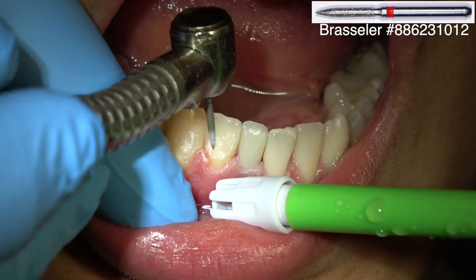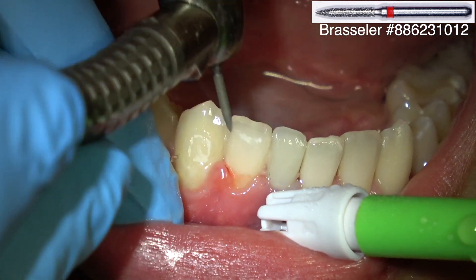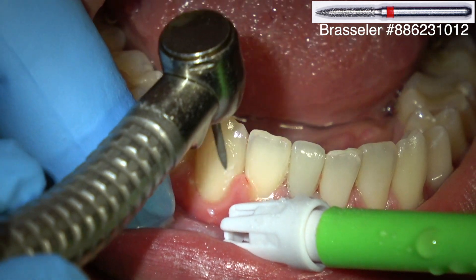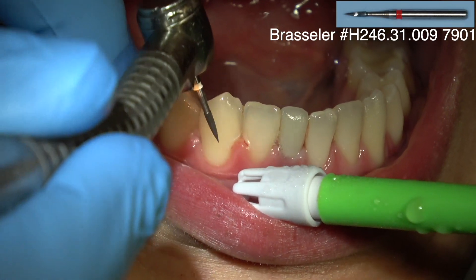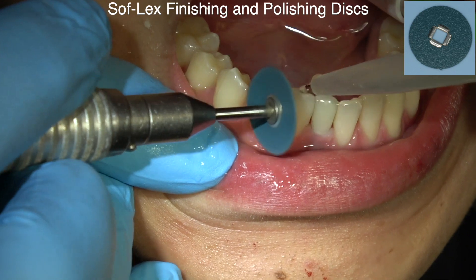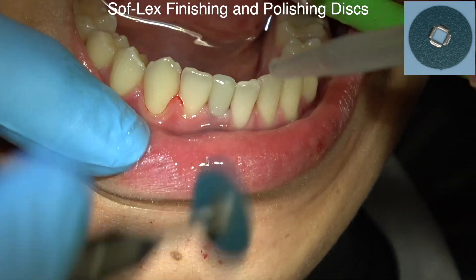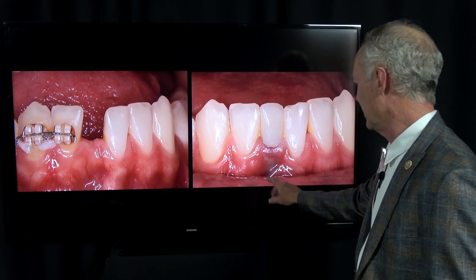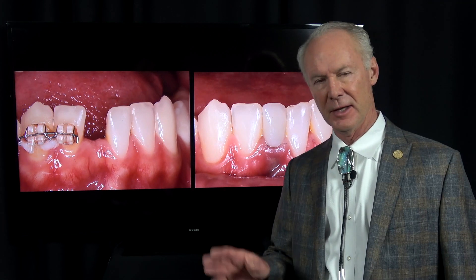Remove these orthodontic wires — the patient was undergoing orthodontics at the same time, and the orthodontist wanted the restoration placed before he removed the orthodontic band. So I'm removing them for him this day, just polishing those off with a flame-shaped fine diamond and then a 30 fluted carbide burr. Soft Sof-Lex polishing disc. I like to wet the teeth, and here's the final restoration. You can see how thin this bone and tissue is down in this area — there's bone around the implant but it's not very thick just because this bone is not very thick.